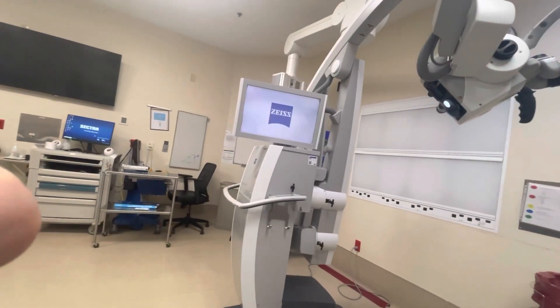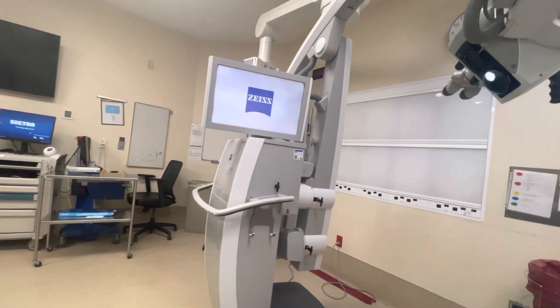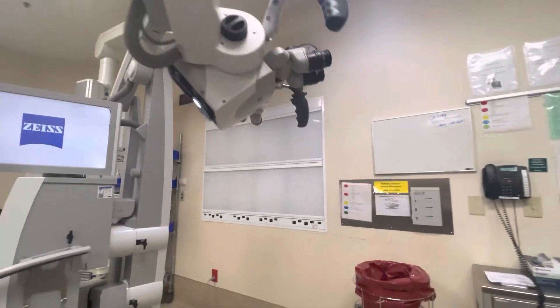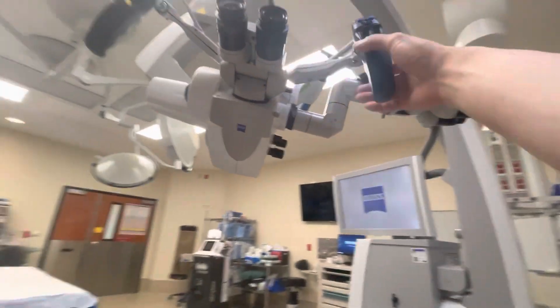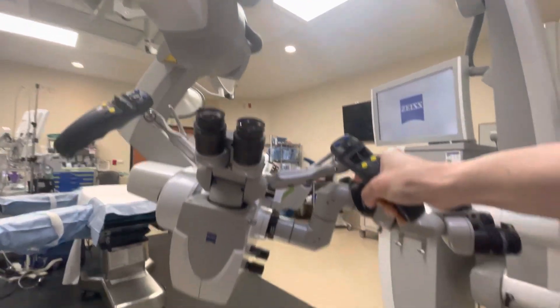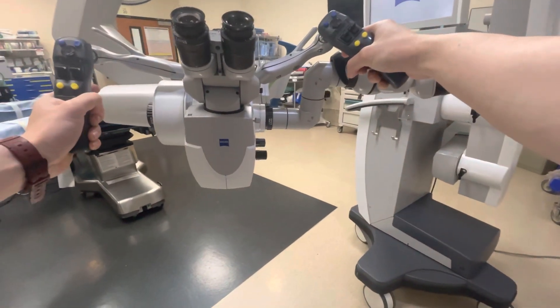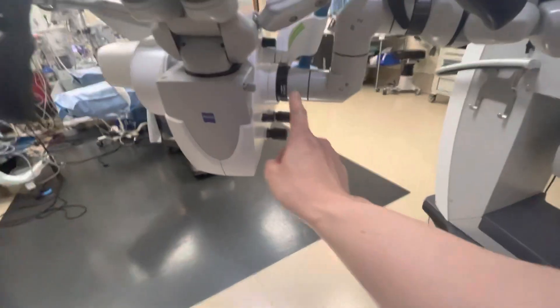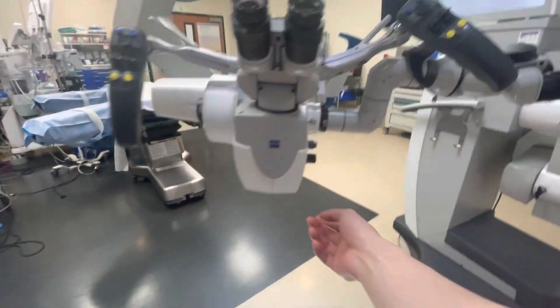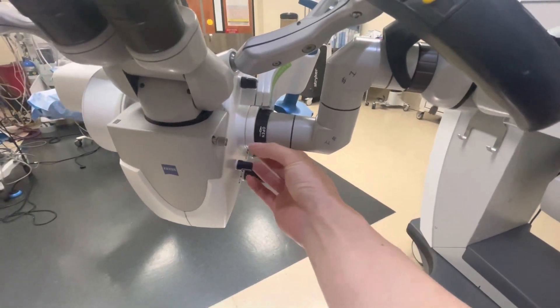While it's booting up, I'm going to be efficient with my time and start adjusting the microscope observer arm. For head and neck free flap cases, the observer port is going to be face to face. For otology cases, you want to put the observer arm on the opposite side of the surgery. Right now the observer arm is on the right, and I'm going to put it on the left side because we're doing a right-side case.